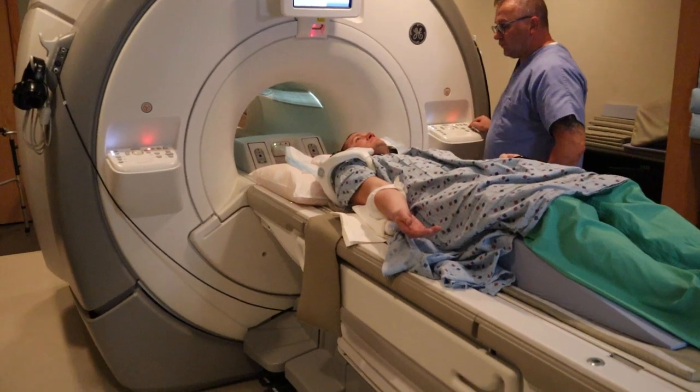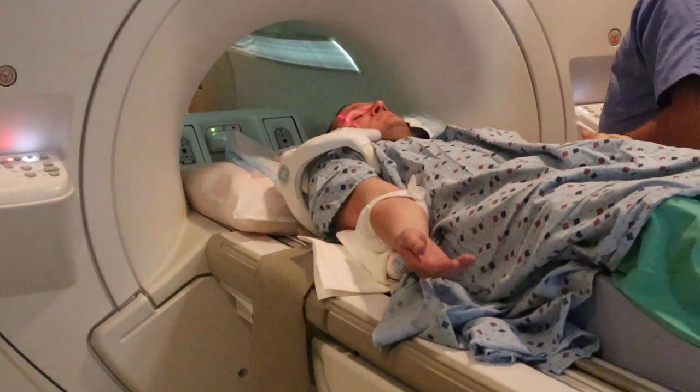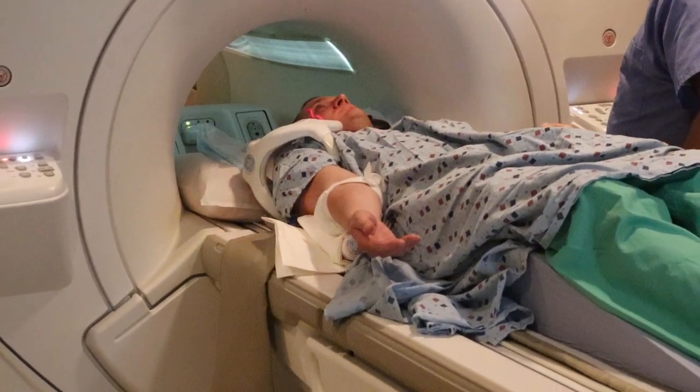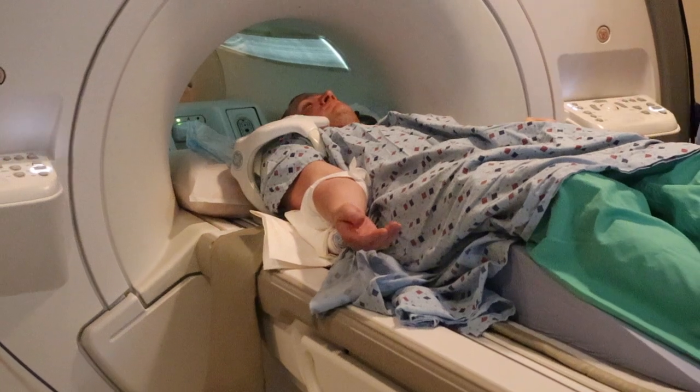You want to advance the patient. Landmarking will be at the coracoid process. Landmark and advance to scan.